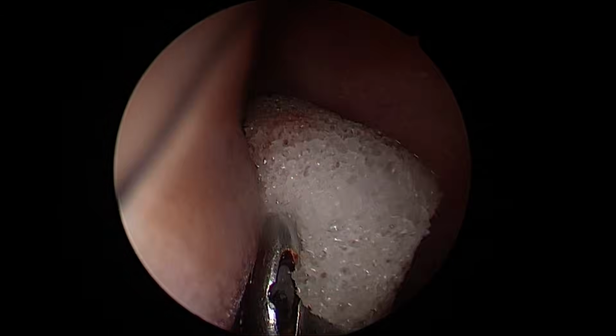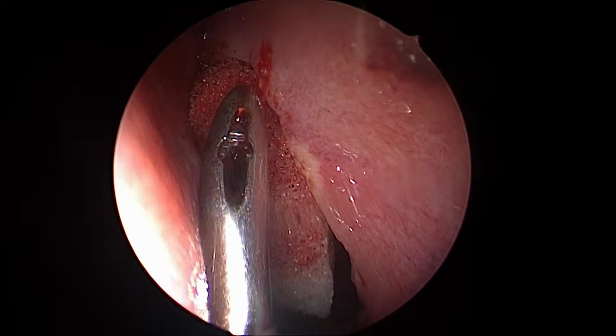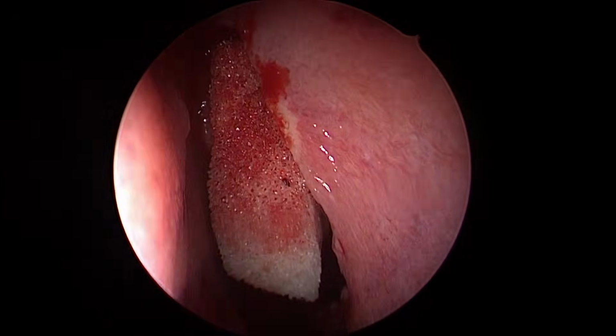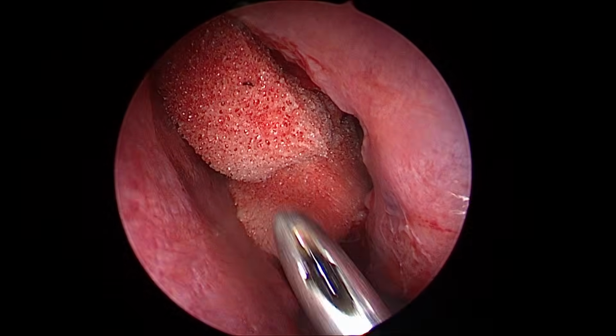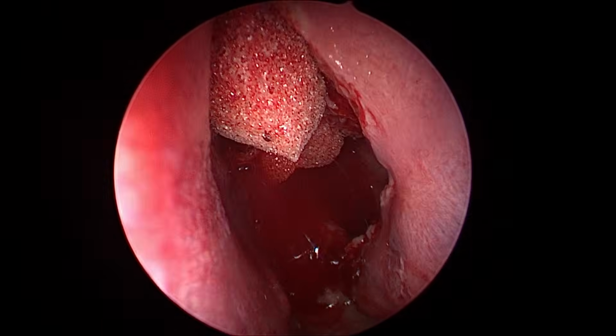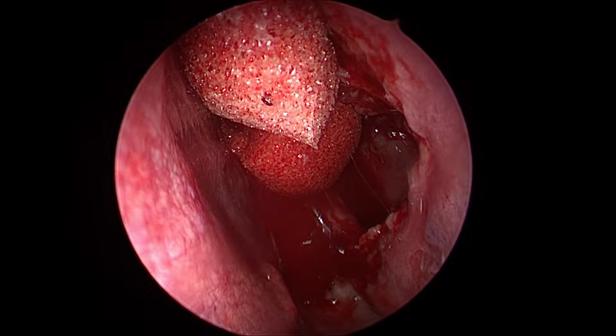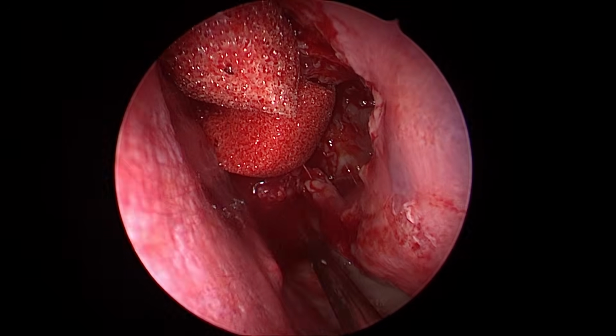We are following the beak. I have shown you on CT scan. Follow the beak, what is there behind? Frontal. It cannot change. It is God's given anatomy. Whatsoever the cellularity in the frontal recess is, this anatomy will never change. Whatsoever the number of revision surgeries to remove the landmarks, unless the beak is drilled, this is never changed. What an amazing landmark for the frontal, which I am going to show you.